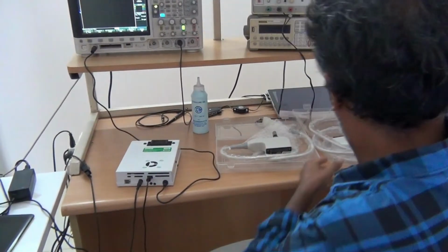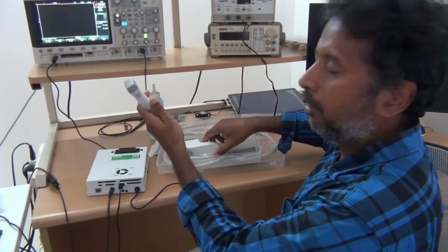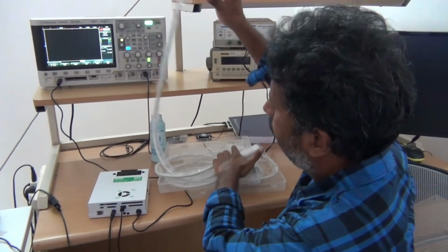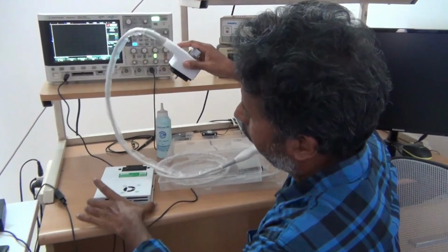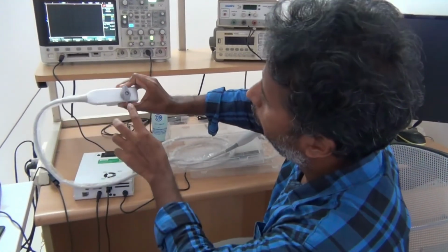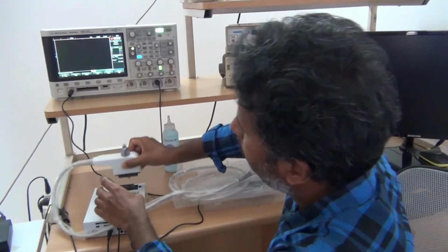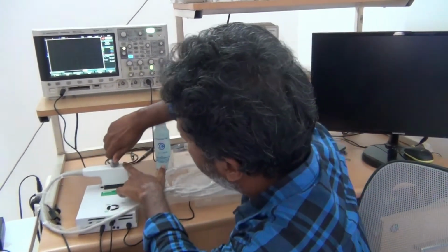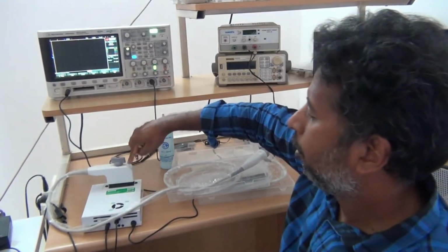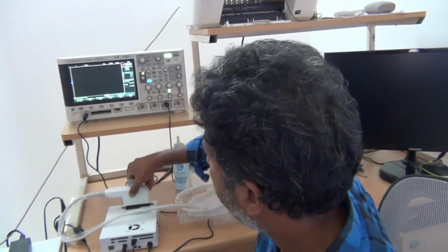Now coming to the probe. So this is a 3 megahertz probe. This is the front side of the machine. I connect it with this orientation. Now it should be in the 6 o'clock, 12 o'clock position. I plug it in and make it 3 o'clock, 9 o'clock. Now this probe is connected securely.